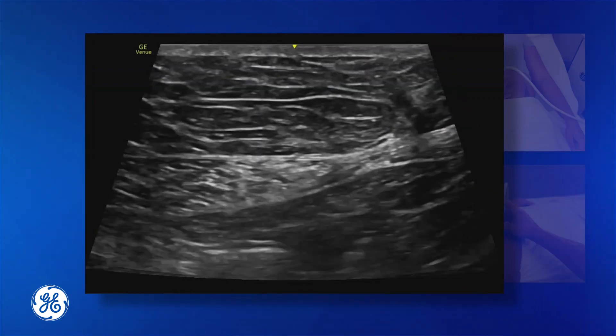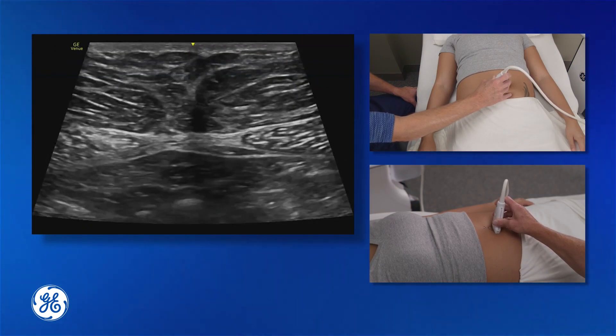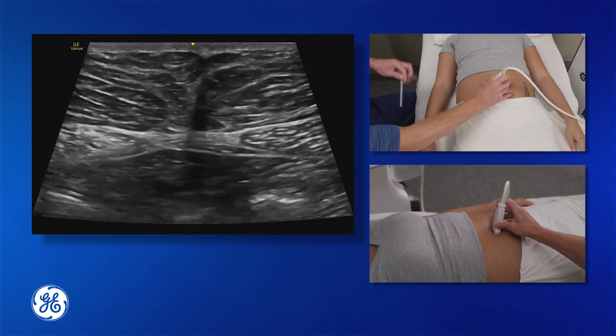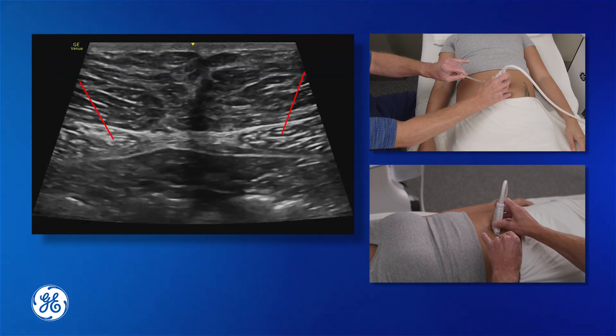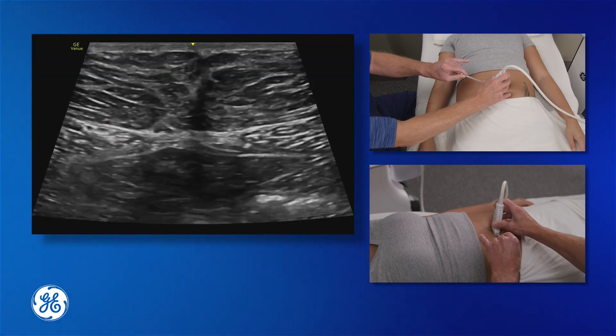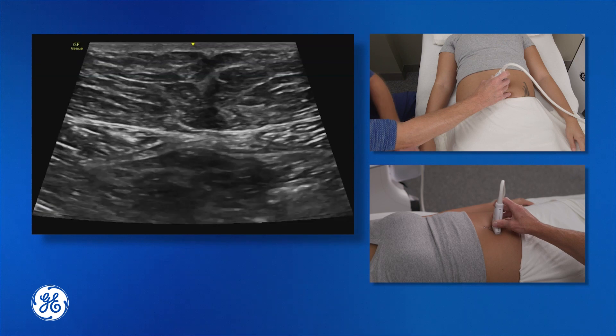We are going to need to do this block bilaterally. In the transverse plane, we hold our probe, take our needle, and insert it from either lateral side of the probe, making our injectate below the muscle but above the posterior plane. That is the transverse view of the rectus sheath block.